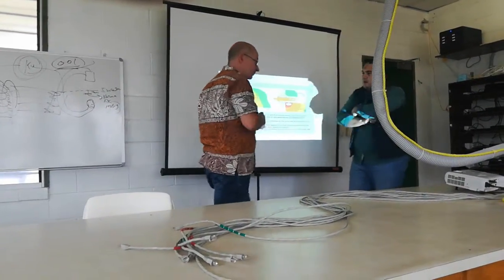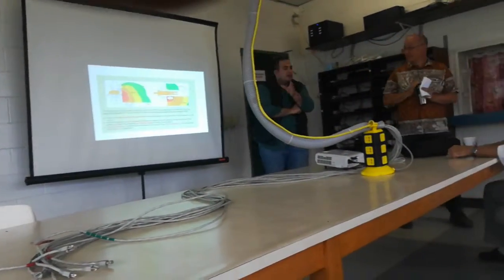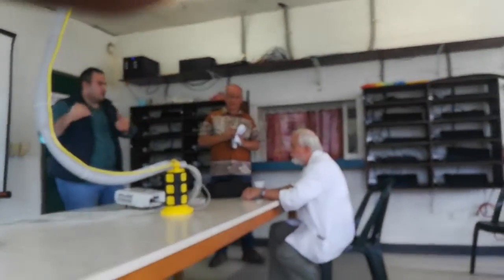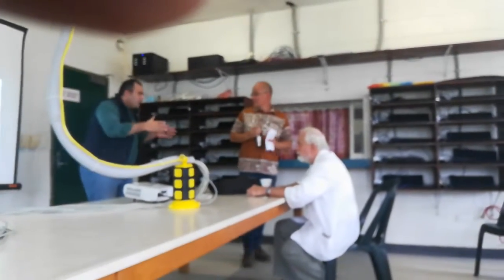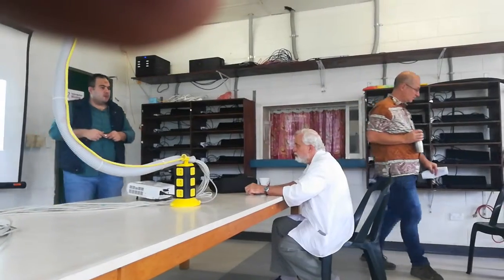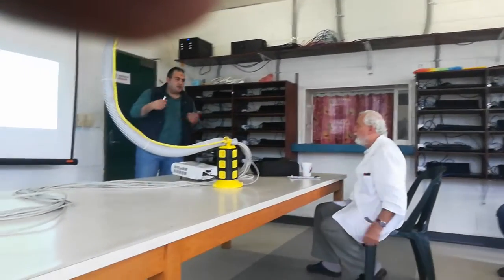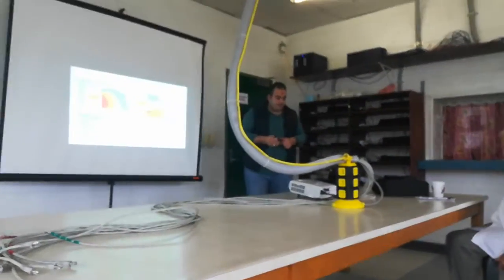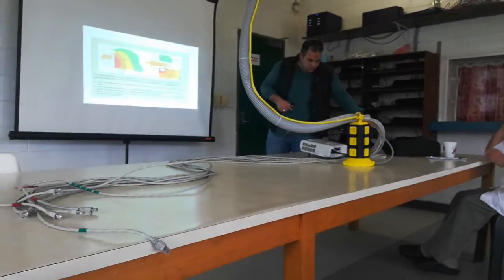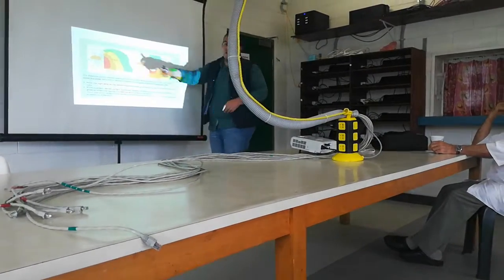We have this option. You can mount a lead apron, or sometimes you will find the table mounted with lead or a shield. You can use it, or you can build or manufacture one, to protect the worker from the scattered radiation.